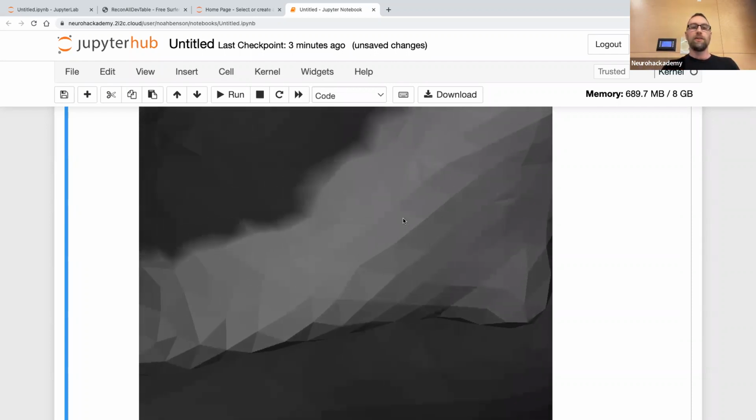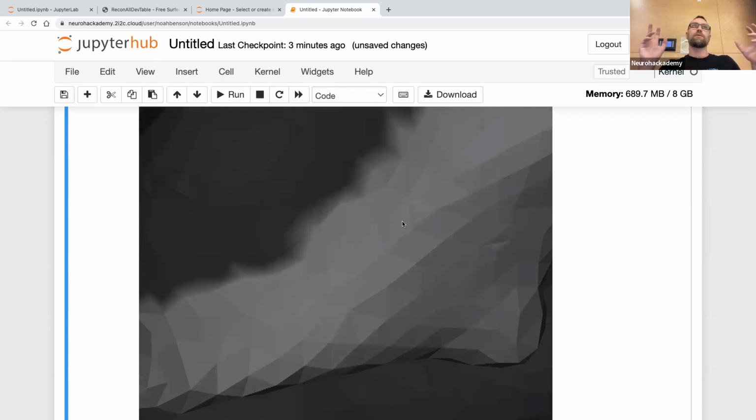But ultimately, when I say that FreeSurfer tessellates the surface, what I mean is it figures out where the surface is based on the contrast of the voxels, and then it fills that surface with vertices and triangles that are all about the same size. And it does a very good job of trying to make them all the same size, although obviously they're not exactly the same size.